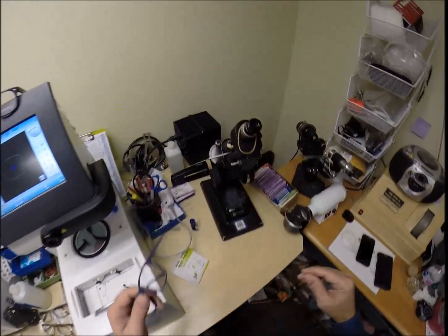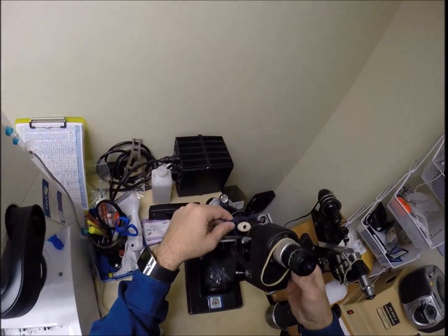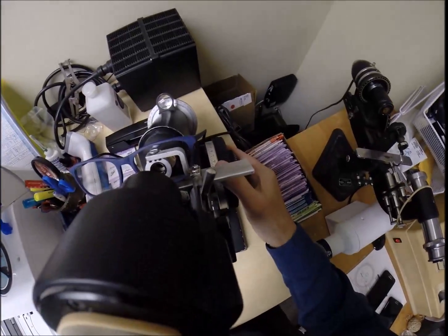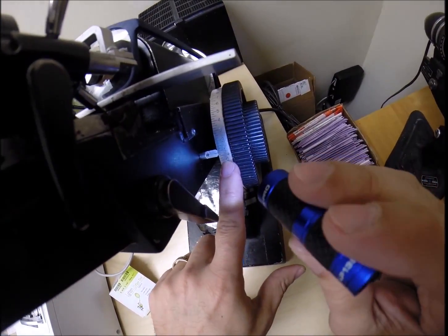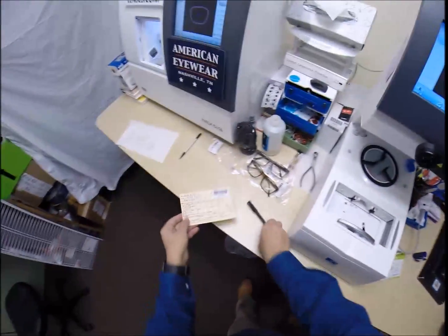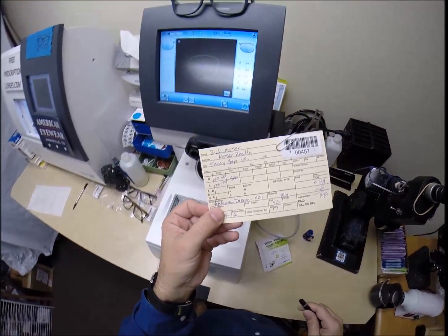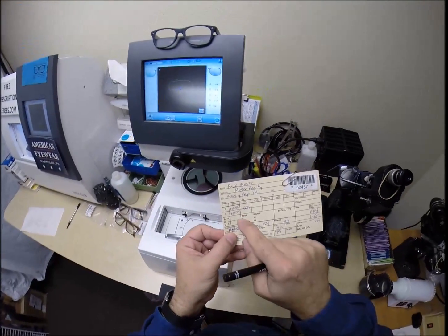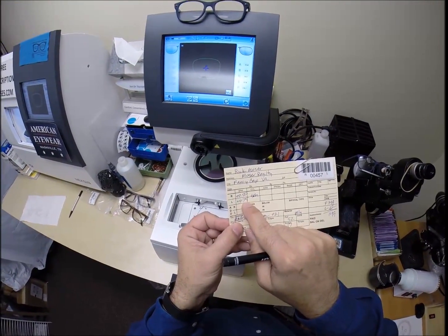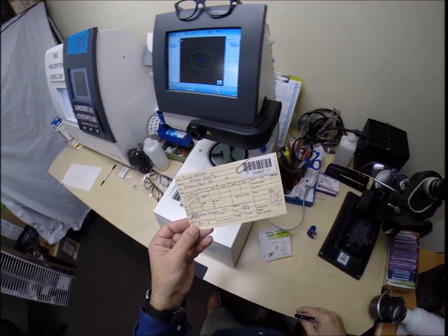So we're going to come down here to the lensometer, put it in just above that black dot, which is where his pupillary distance is, read the power, and I am getting plus 75. One tick mark away from 1. So you need 3 steps of magnification for your left eye. Now, most over-the-counter reading glasses start at 1 1/4. You might be lucky to find one at 1. The only problem is his eyes are different. He needs a different power in each eye. So that's why I'm custom making these for him.